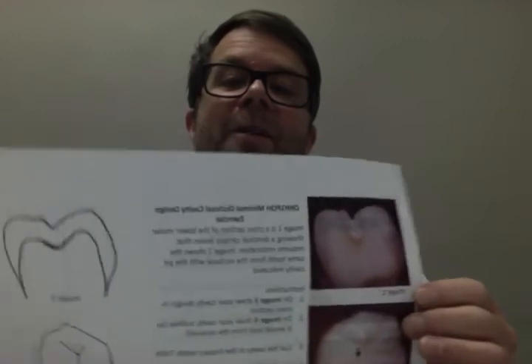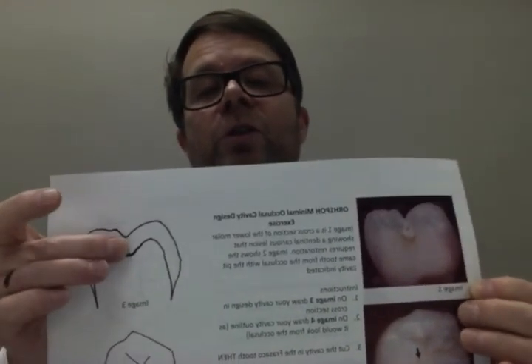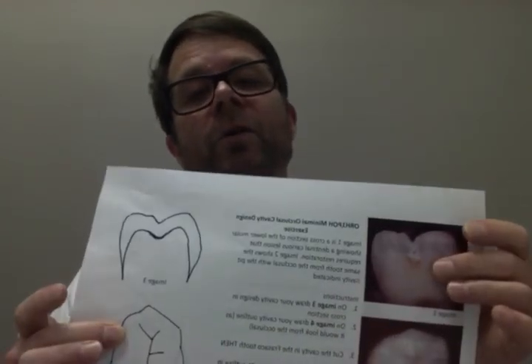And then on the other side of the paper, again reproduce your diagram, cut your cavity in another part of the tooth and compare that with your ideal process. We'll then move into the mouth where you can do exactly the same thing.